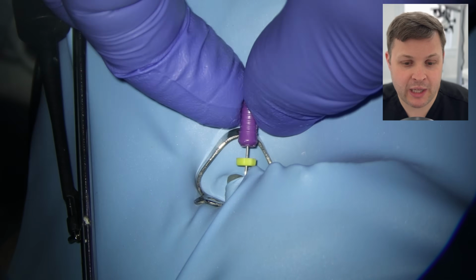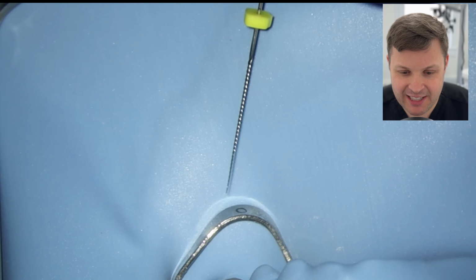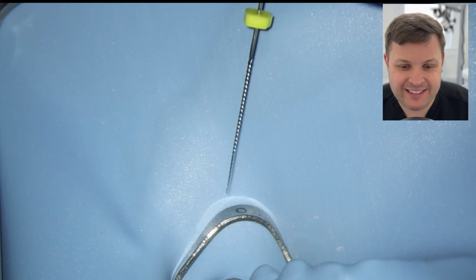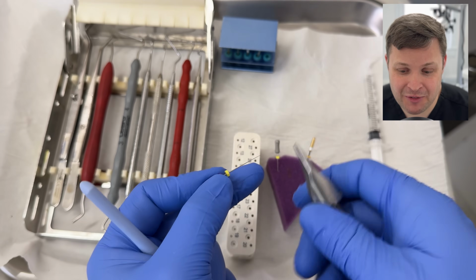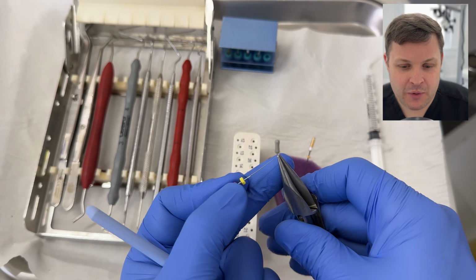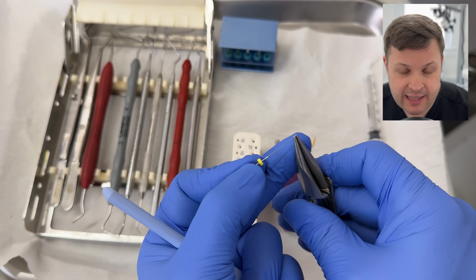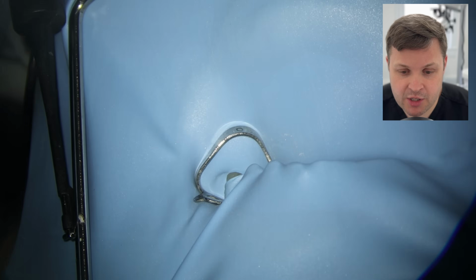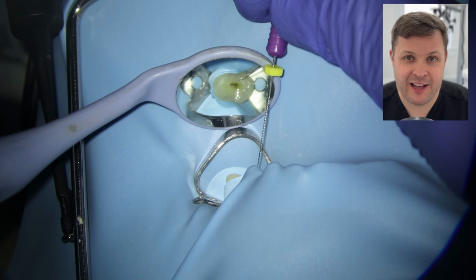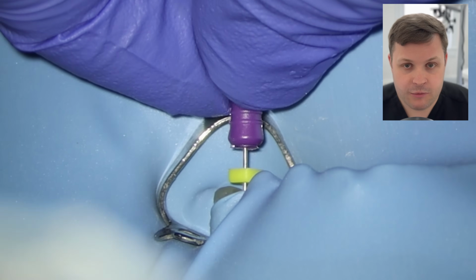Worst thing to do now is pull it out. You're just going to be moving the hand file up and down nicely, and you'll notice that when you put a lot of pressure on these files, they lose their bend. Also, you just have to be careful for file fracture. So always maintain the bend, pull it out, give it a little bend, and check the end to see if any of the flutes are unwinding. That's another sign that the hand files are about to break. If you're seeing flutes unwind, you just swap the hand file and introduce it again.